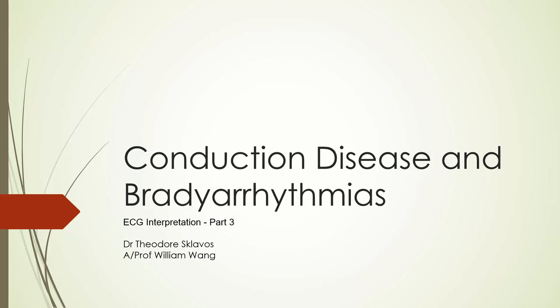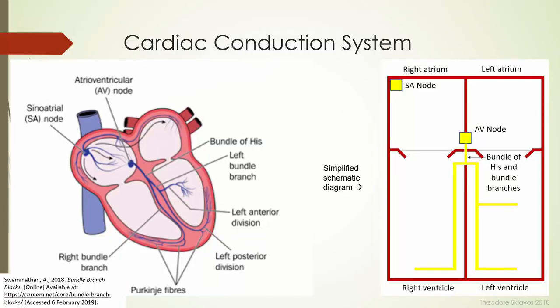Welcome back to this ECG interpretation series. In part 3 we're going to be talking about conduction disease and bradyarrhythmias, so the slow arrhythmias. We'll briefly revise the normal physiology first.